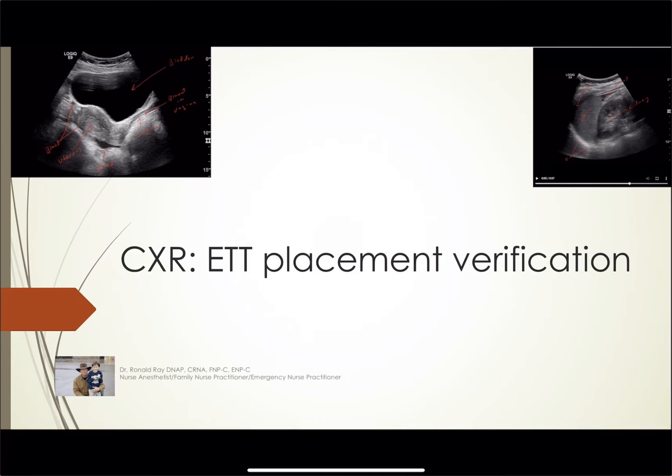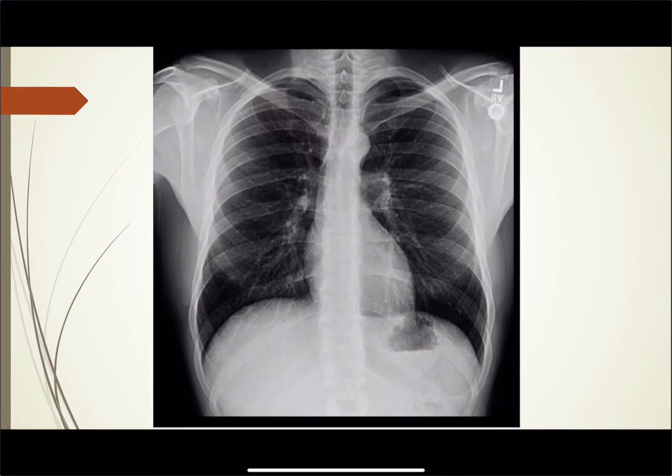Hey all, I'm back. A short podcast on chest x-rays and verifying ET tube placement. I hope you all enjoy. This is a normal chest x-ray and I'm going to run over the basics again real quick.